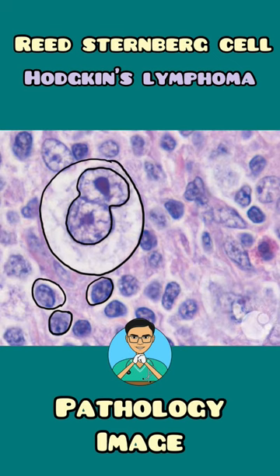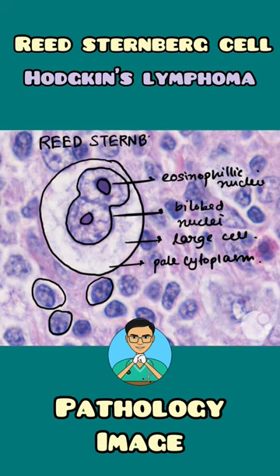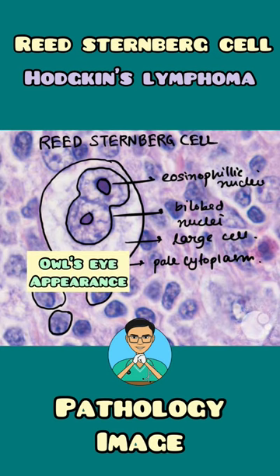And within the nucleus, we have eosinophilic nucleoli. And as we can see, they have pale cytoplasm. So this cell is known as a Reed-Sternberg cell, and it is seen in cases of Hodgkin's lymphoma.